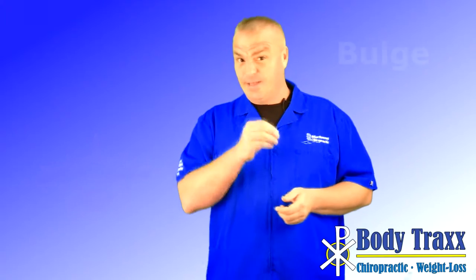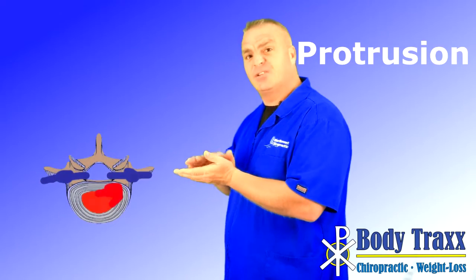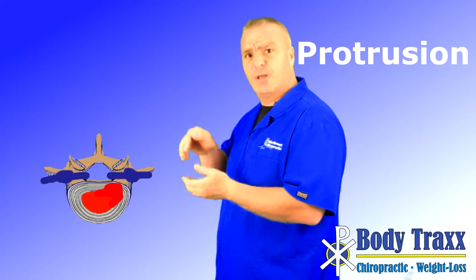On the MRI, it's going to say the person has a posterior lateral or some other term that's going to define which way the disc is bulging. And if the word is a posterior lateral disc bulge or posterior lateral disc protrusion, it's going to look more like this here. And you can see it's just a continuation, a little bit longer.